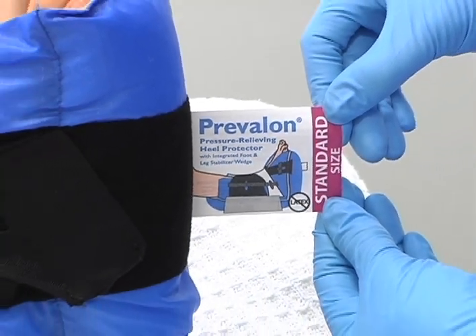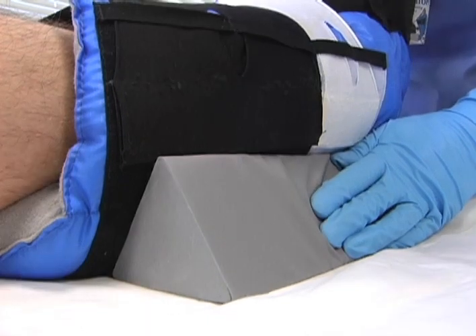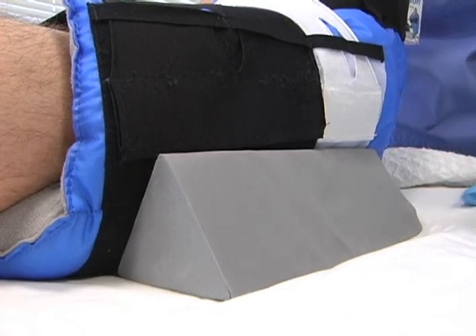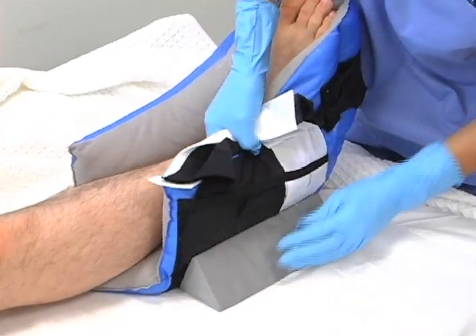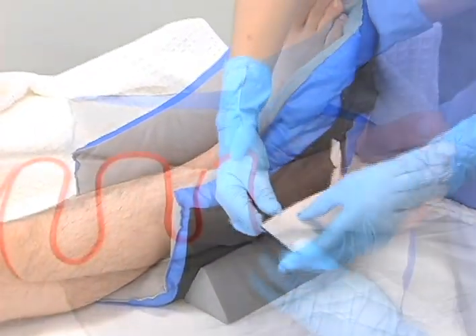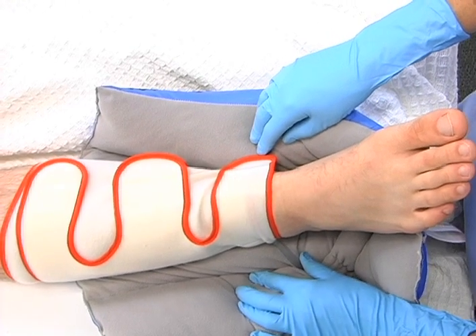If the tag is at the bottom of the boot like this, it is on correctly. If the boot has an integrated foot and leg stabilizer wedge, position the wedge on the outside or lateral side of the leg. Carefully affix the wedge to the side of the boot. If using an SCD, check the tubing to make sure it isn't kinked or bent inside the boot.